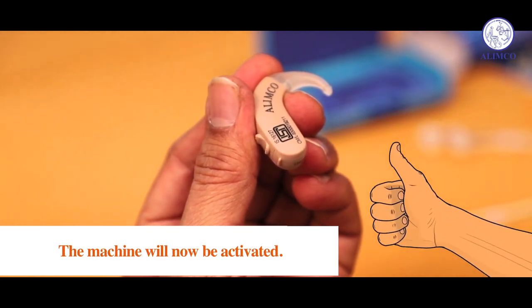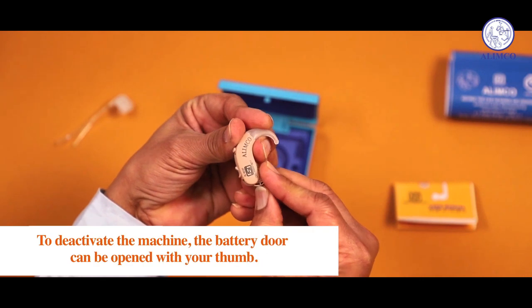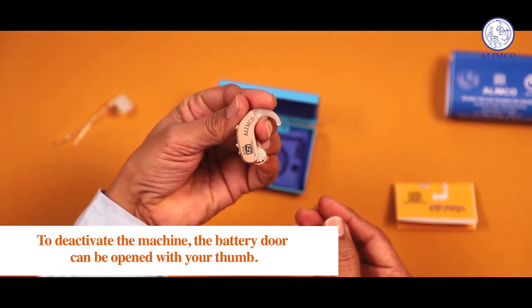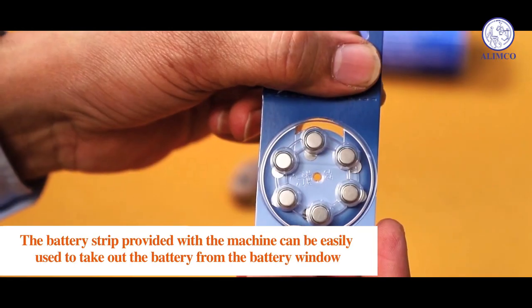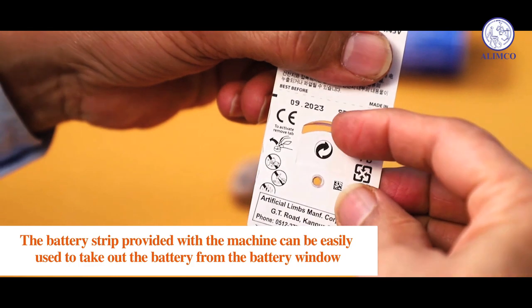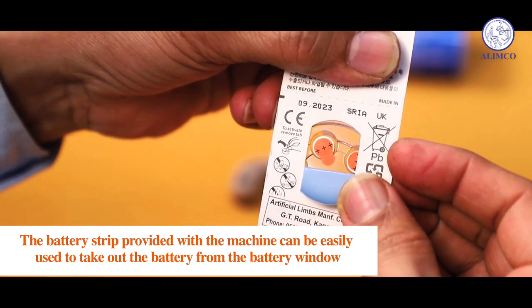Push and close the battery door again with your thumb — the machine will now be activated. To deactivate the machine, the battery door can be opened with your thumb. The battery strip provided with the machine can be easily used to take out the battery from the battery window.